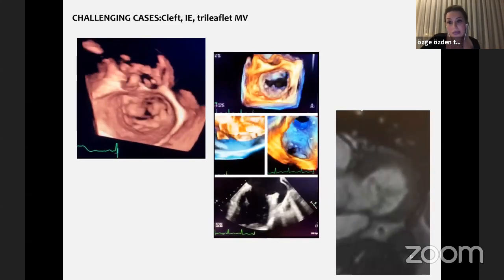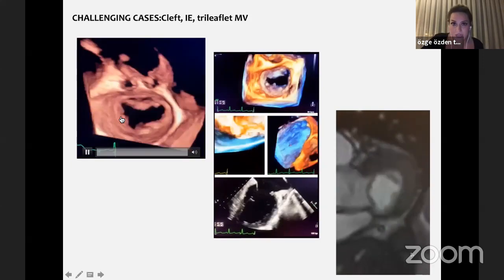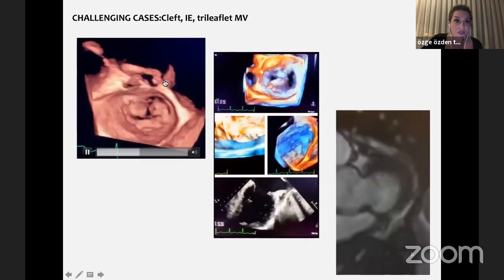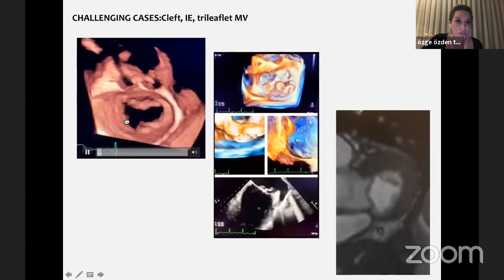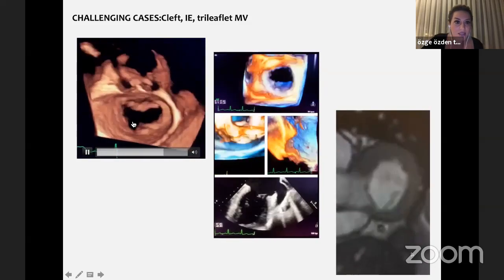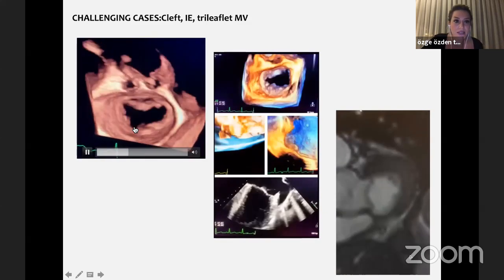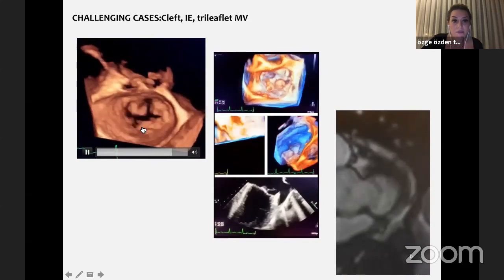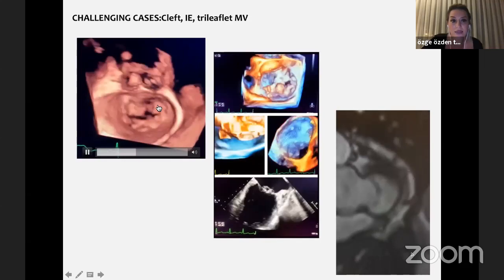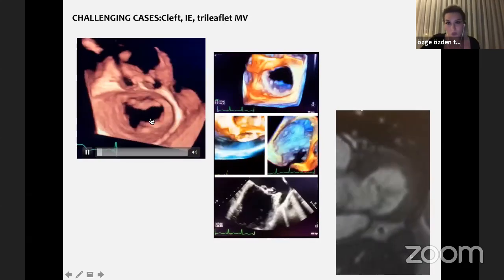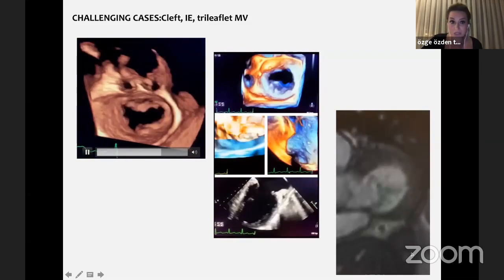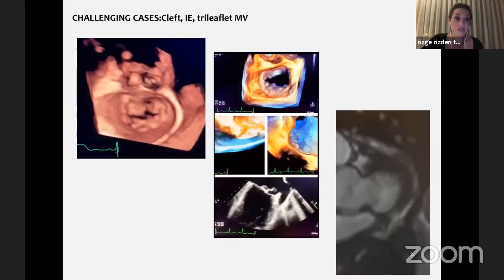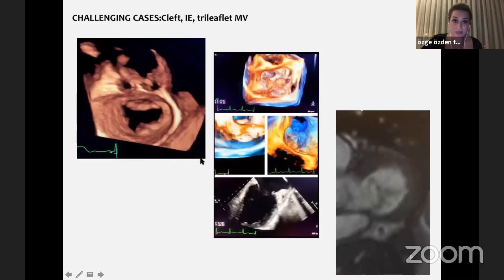In this en face surgical view with the aortic valve at the 12 o'clock position, this is A1, A2, A3, and P1, P2, P3. We can appreciate the cleft between P1 and P2 scallops, and even between A2 and A3 there is a deep indentation — almost a cleft. So this patient is not a very good candidate for MitraClip. There are cases in the literature done with such clefts, but they are rare.